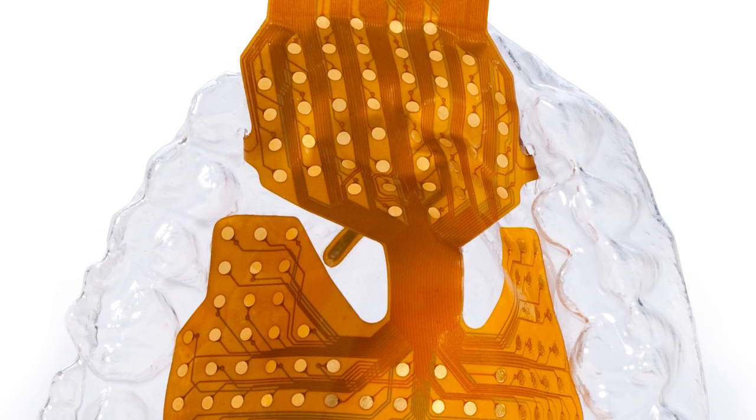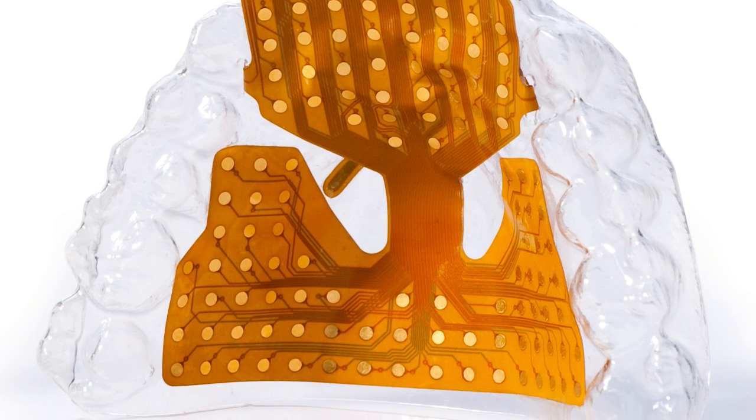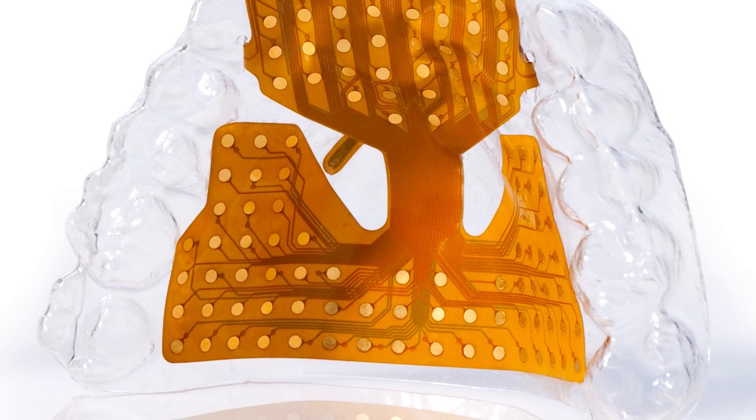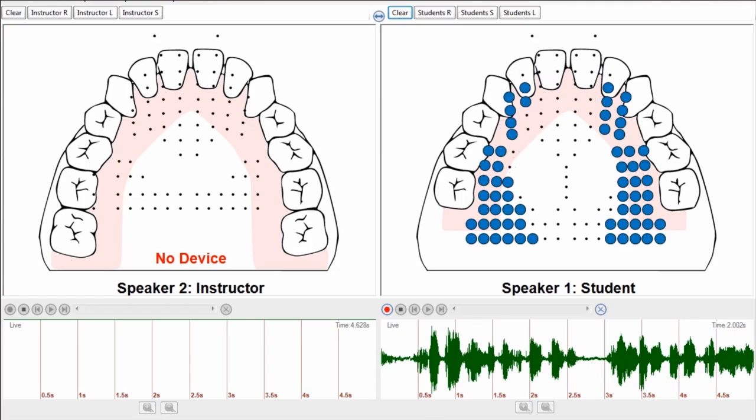The Smart Palette reads your tongue to palate contact, providing visual feedback that eliminates guesswork.